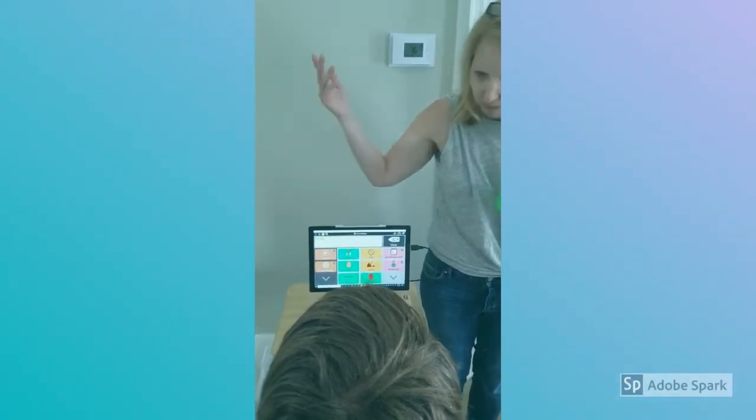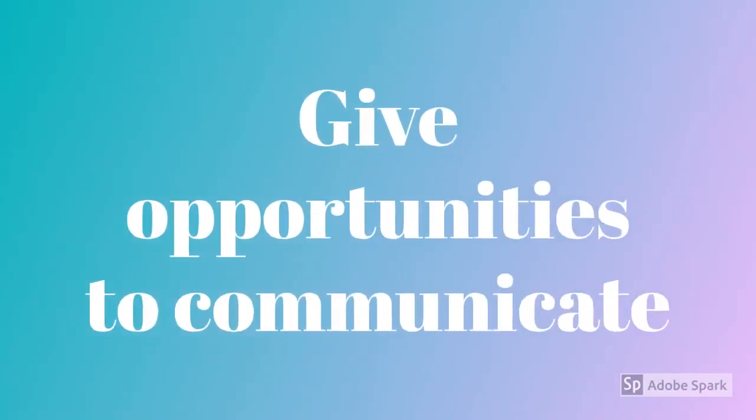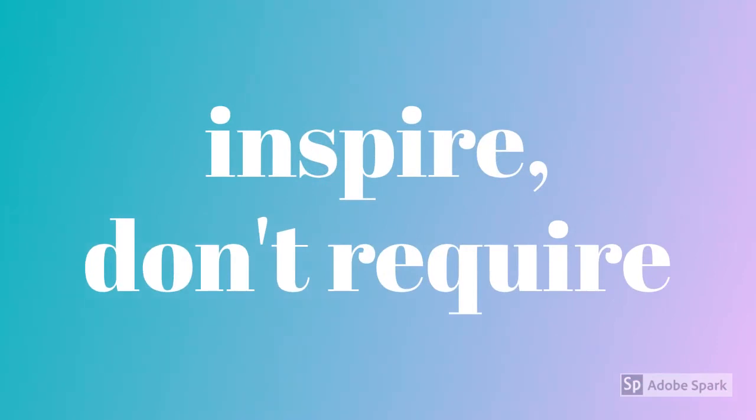Oh, stop. It stopped. Once you get used to using your student's communication device to talk to them, pause and give them an opportunity to respond back. They may not want to respond at first, but that's okay. Don't force it. Remember to inspire them to communicate, but don't require it.